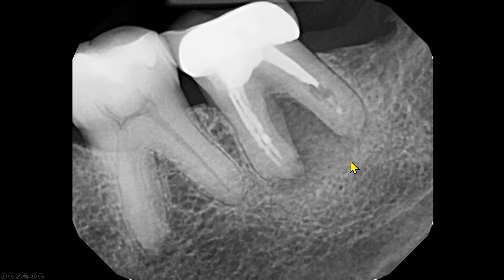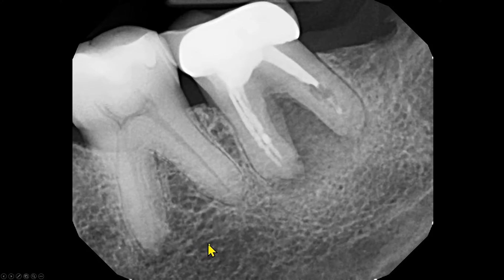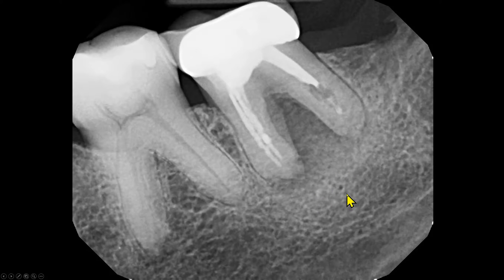The trabecular pattern is lost. A good trabecular pattern is such that if you have a fine pencil, you will be able to draw this. In this area, that pattern is lost. It's fuzzy.